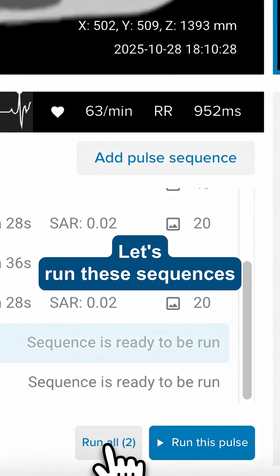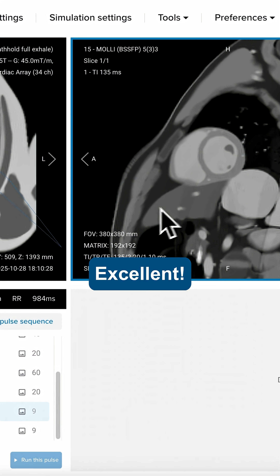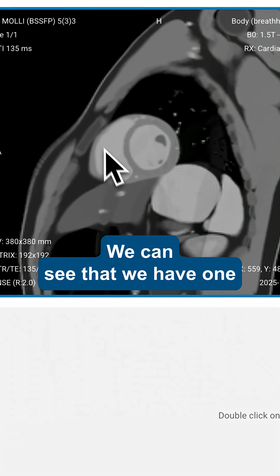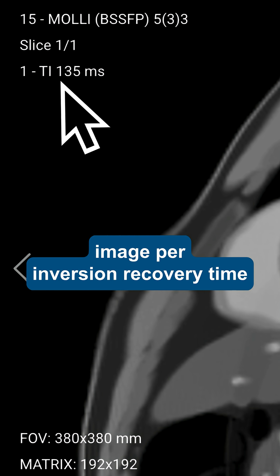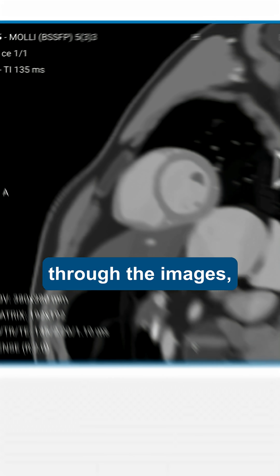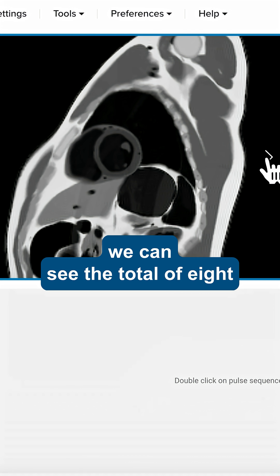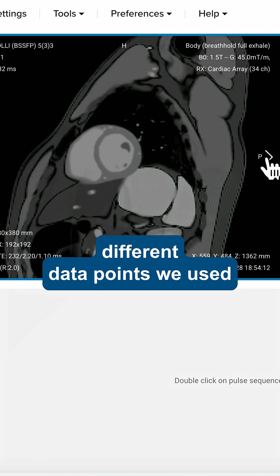Let's run these sequences. We can see that we have one image per inversion recovery time, so if we scroll through the images, we can see the total of eight different data points we used.